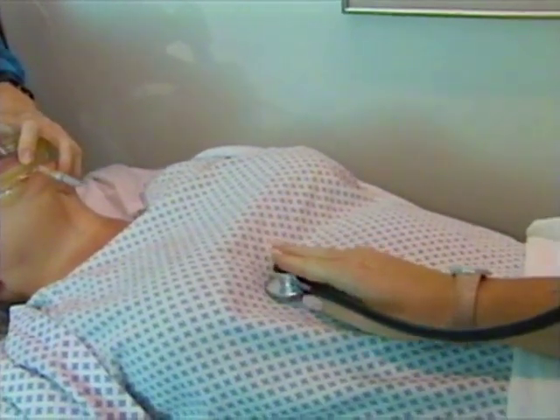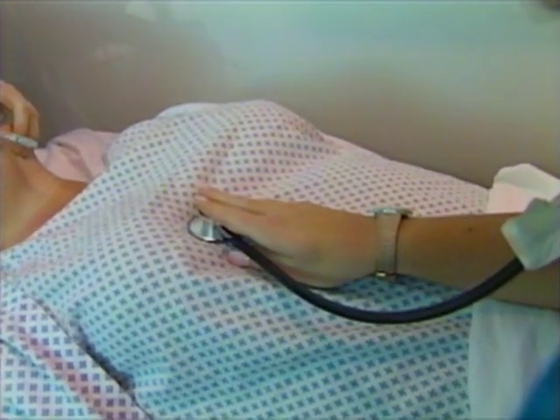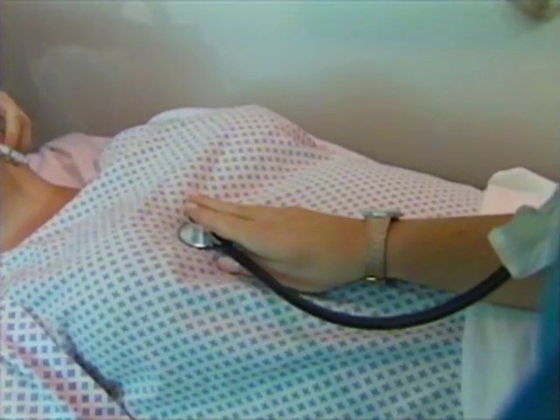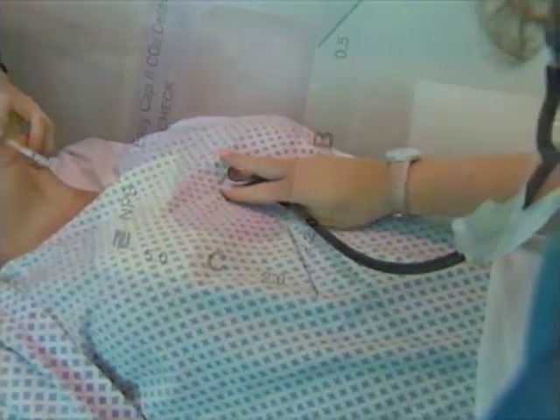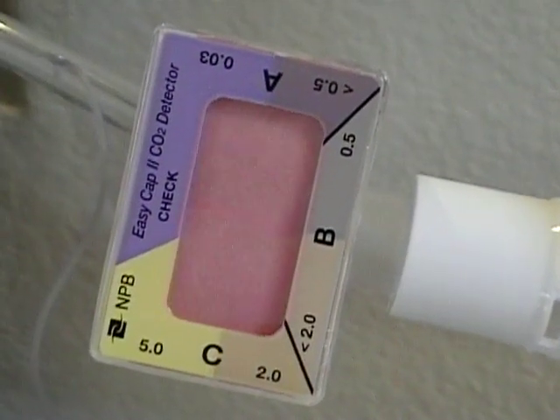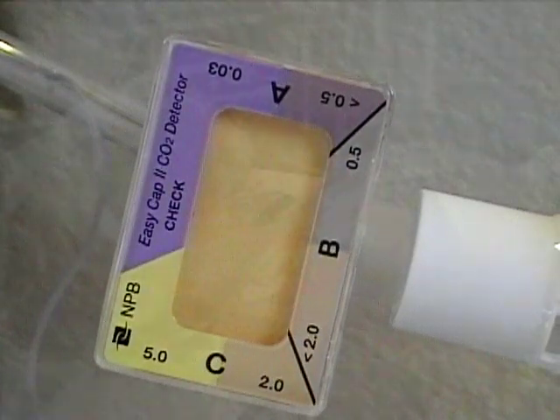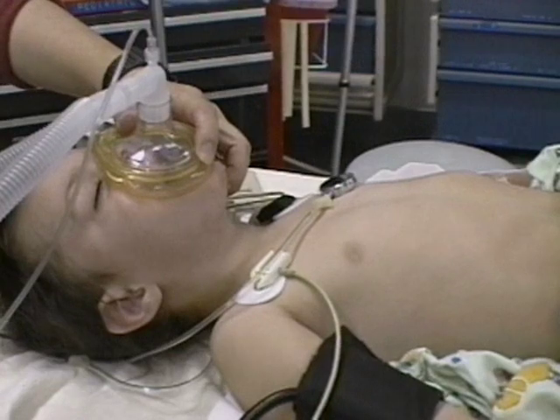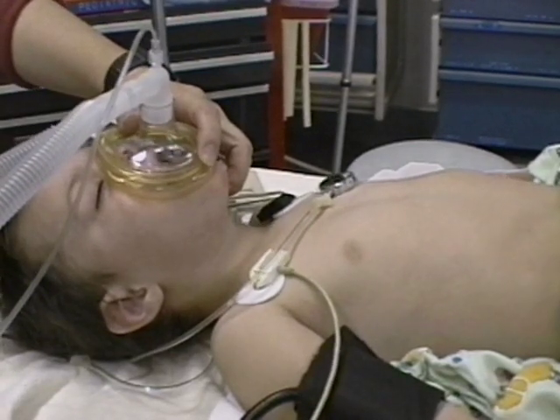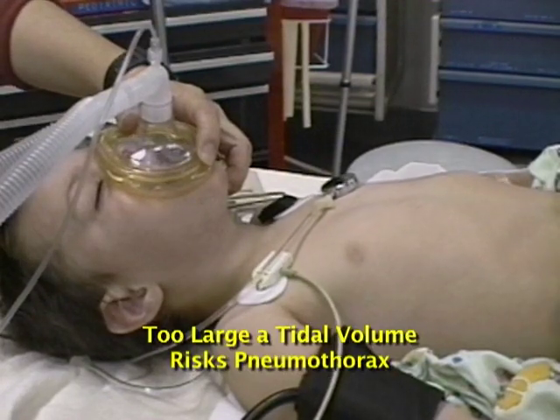When in doubt, have a helper listen to the chest as you ventilate. You should hear breath sounds. Although there are some medical conditions where breath sounds are hard to hear, the absence of breath sounds almost always means inadequate ventilation. If an end-tidal CO2 device monitors the patient, you should see evidence of exhaled CO2. Always use the least force required to effectively inflate the lungs. Too large a tidal volume risks pneumothorax, especially with children.